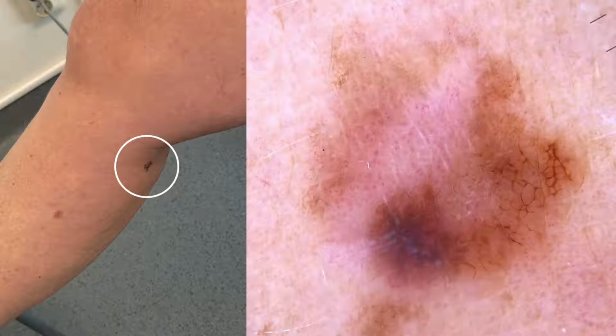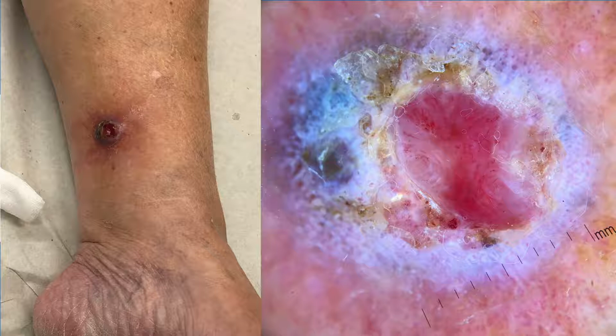So all of these are indicating a possible invasiveness. Of course, this is also a flat lesion, so it's probably thin invasive. In this example here, we have a clearly raised lesion with multiple colors, blue, white, red, and of course, polymorphous vessels. So atypical blue-white structures, polymorphous vessels, raised lesion, all of these predict, of course, an invasive melanoma.